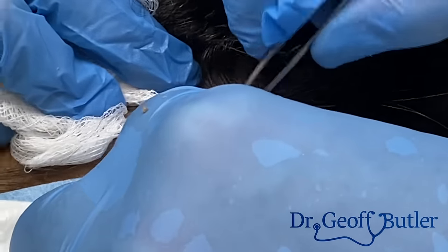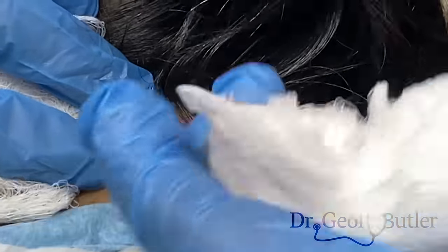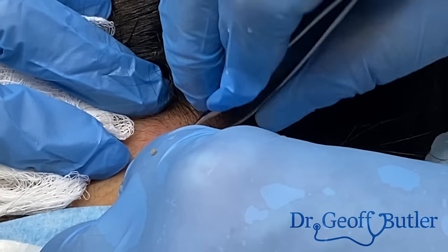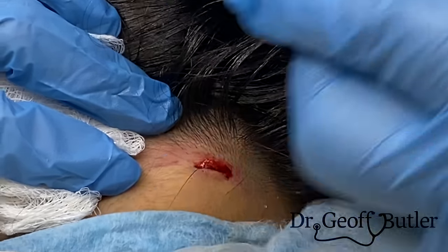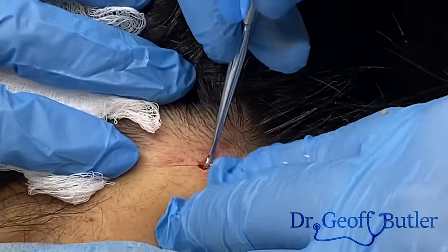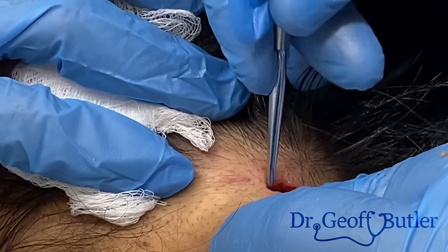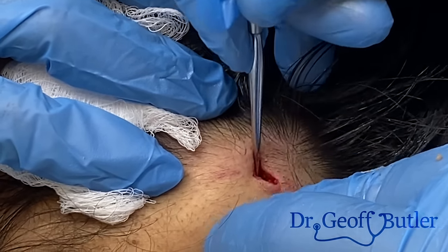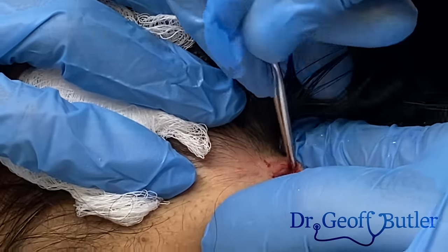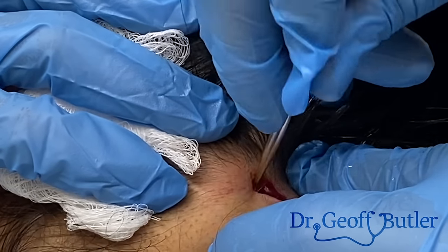Yeah, and it becomes difficult as well, because when it's inflamed like this, the membrane's also 3 times as big or 4 times as big because it's gotten so swollen. So you start to talk about a big area, and thankfully the anesthetic's working okay. In a lot of these cases, despite even adding extra, they'll be uncomfortable, and I can't do this because it's just not reasonable. You can't make the patient super, super uncomfortable. So then we're really forced to rely on doing the packing overnight, and then hopefully the next day some of this breaks off and we can get it out.